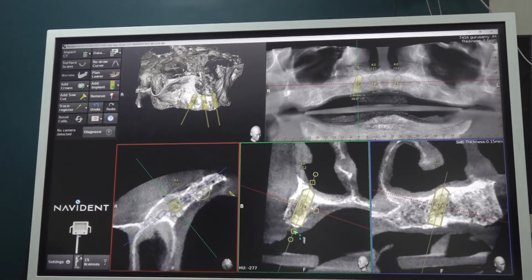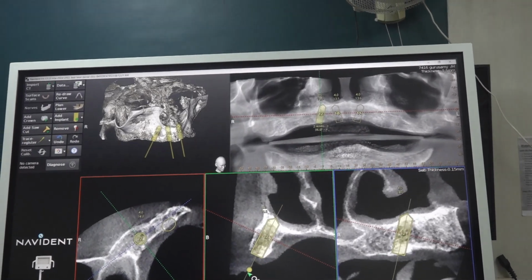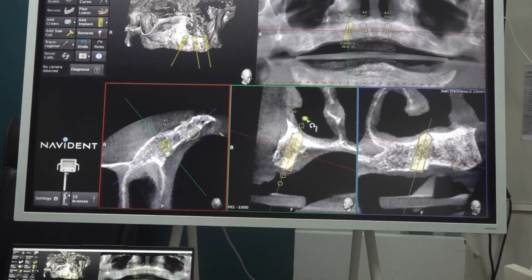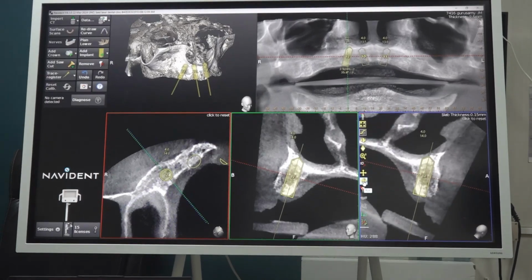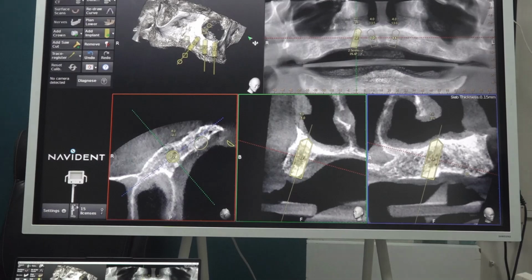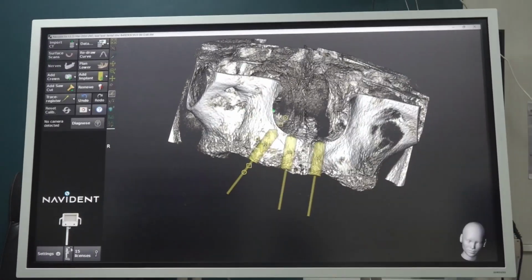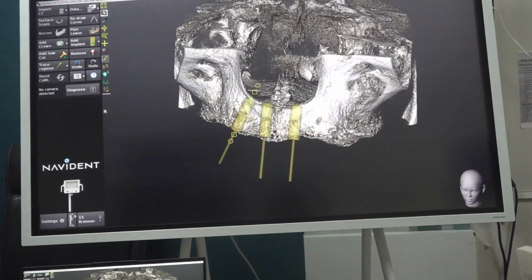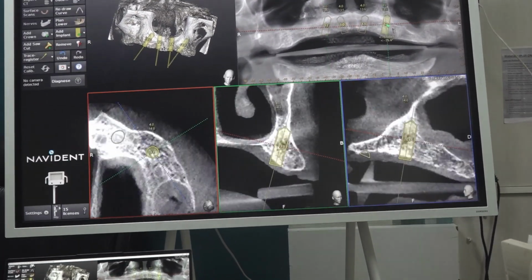We start the drilling from the crest or from the mid crest or the palatal crest. Okay. Here also around 13 mm. So we will open the flap. We will expose the nasomaxillary buttress, the lateral nasal wall, and we will tap like this. This side.